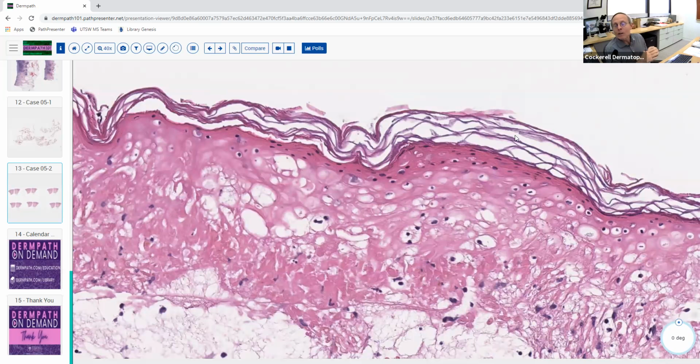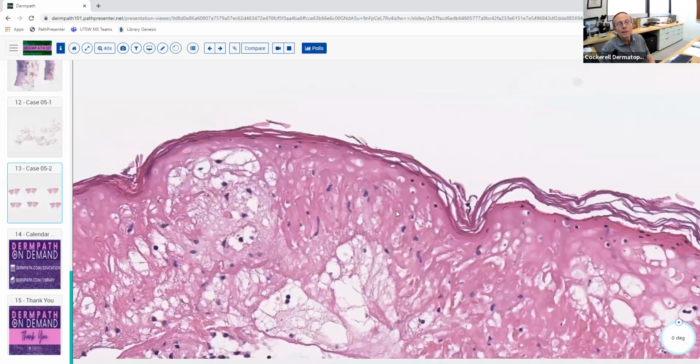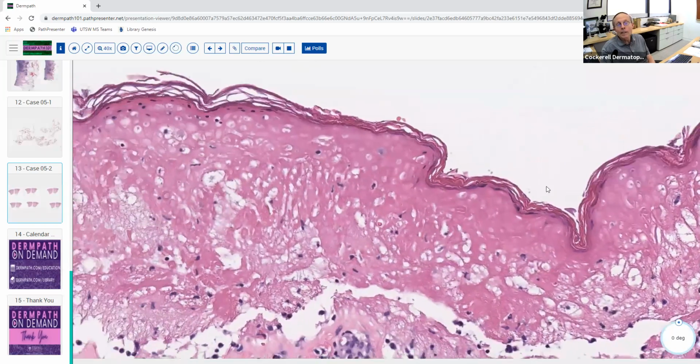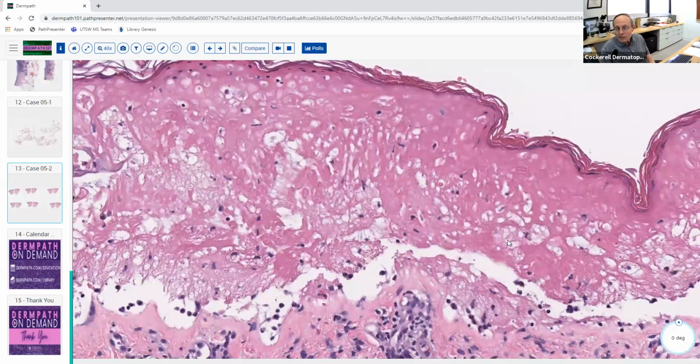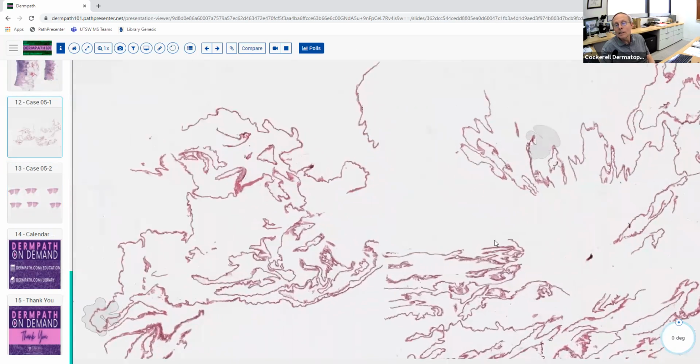This happens very, very quickly. It didn't even have a chance to form any parakeratosis. And notice that it's totally necrotic. Everything's dead. It's just like autopsy. So everything is gone. So we're looking at a confluent epidermal necrosis here. This patient's very seriously ill. The other patient, not so seriously ill.